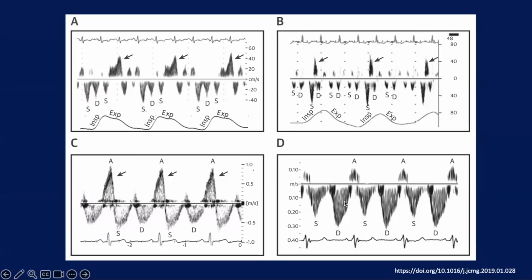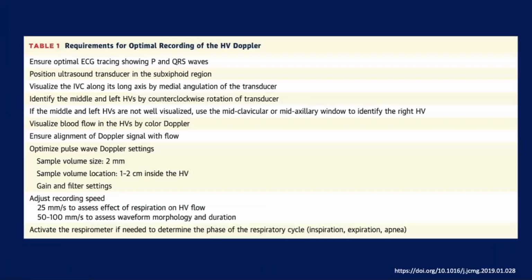This one, any idea? I didn't know it before I read. They say when you have systolic dysfunction of the RV, the S wave will be really low, lower than the D. Before I read it, truly, I had never thought about it. So whatever you know, you will start to notice, which is really amazing. I only took 4 out of 8, 9, 10 things.